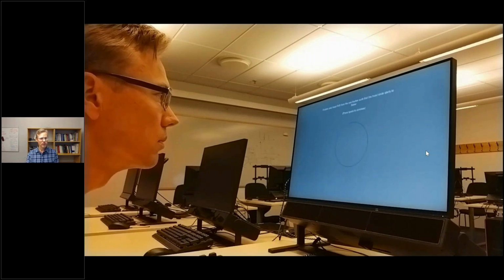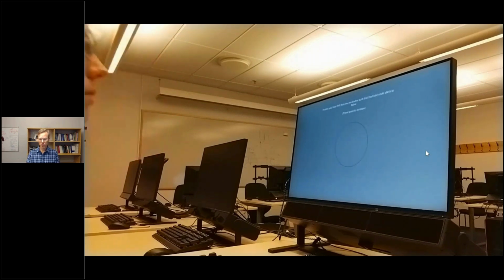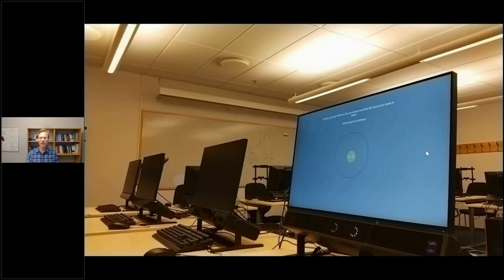And once you've done that, we recorded the last condition where you move as far back as you can while you're still being tracked by the eye tracker. So you can see again, moving far back, until the yellow circle, which is an indication of where the head is in the headbox, starts flickering. And then I repeat the task again. So that's basically the very, very simple test we do.